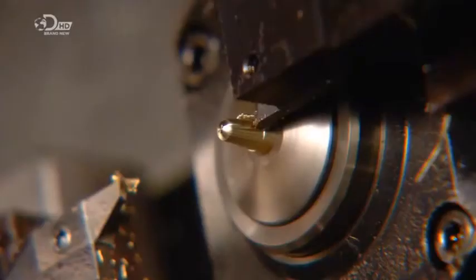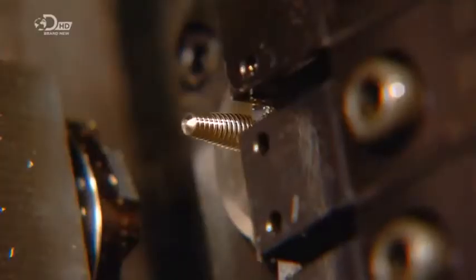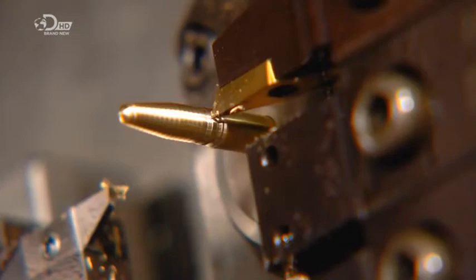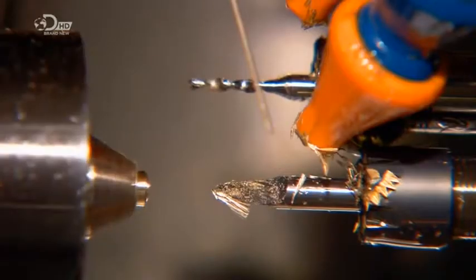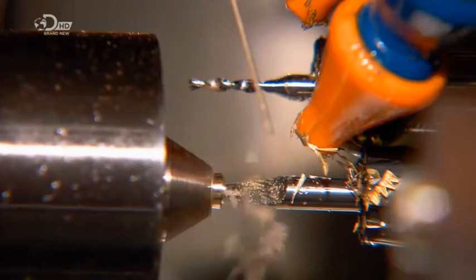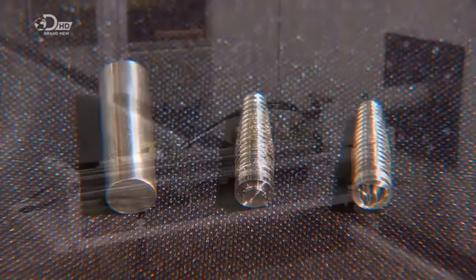The titanium rod spins as computerized tools slim it down and cut threads into it. These threads will help anchor the implants in the patient's jaw. The lathe pushes the rod out and then pulls it back in repeatedly to assist the shaping process. A tool grips the implant while another cuts it to length. Then a computerized drill hollows out the implant and carves threads inside for attaching the ceramic tooth. In minutes, a solid metal cylinder becomes a hollowed and threaded implant.